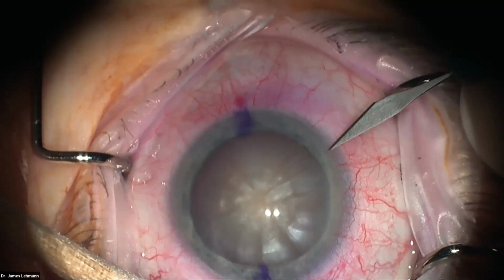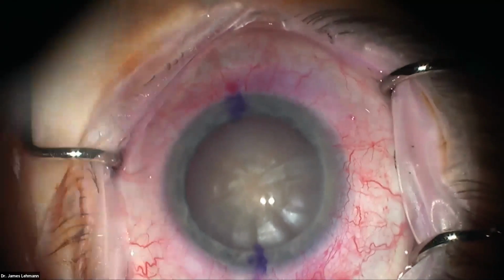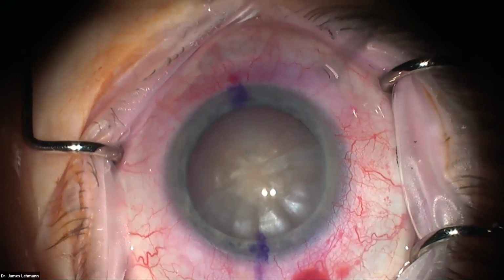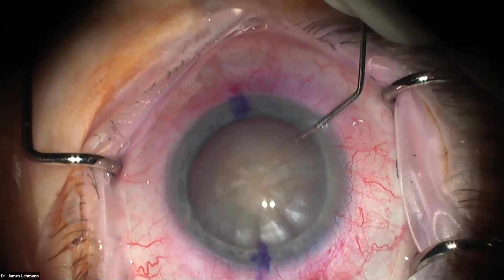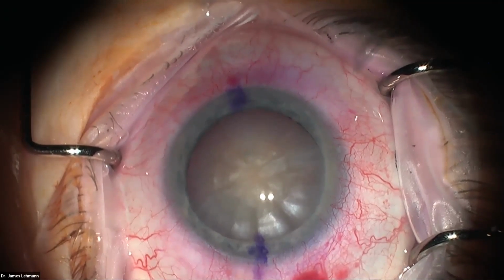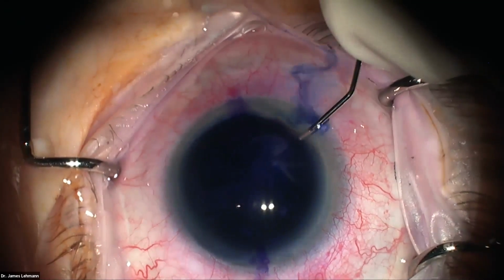And so I'm going to start with my paracentesis wound, and then obviously the mature cataracts can be tricky when doing the Rhexis. It's the hardest part. They want to run out, and oftentimes there's an imbalance in the pressure, with high pressure in the capsular bag and low pressure in the anterior chamber, that causes that Argentinian flag sign. So the Femto works nice in these cases.